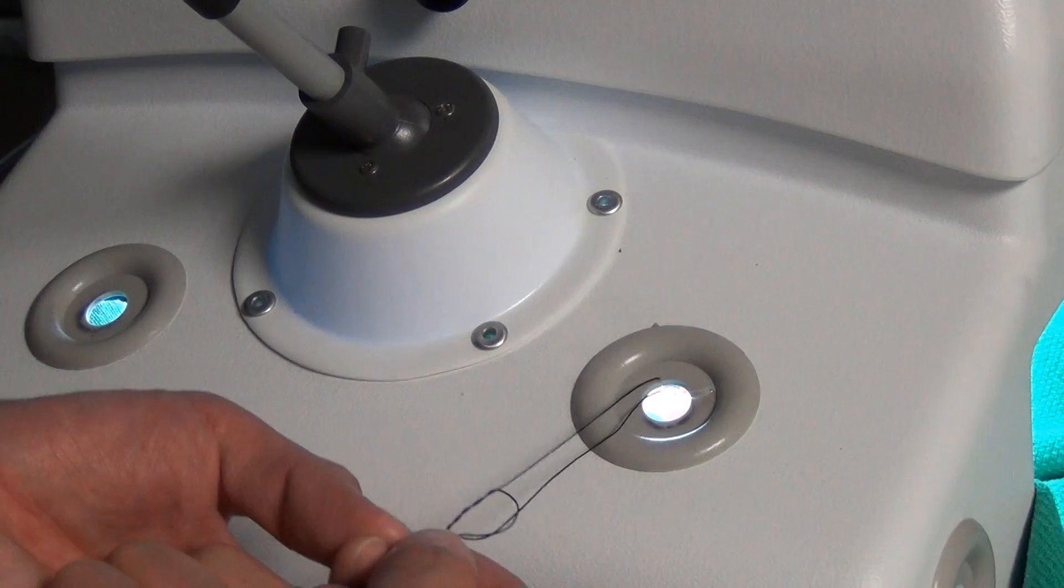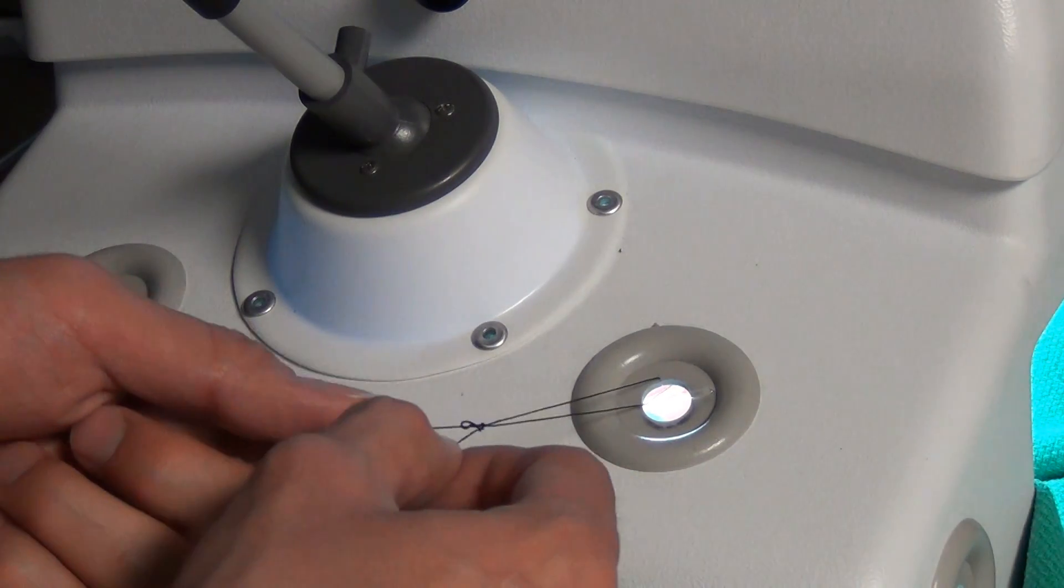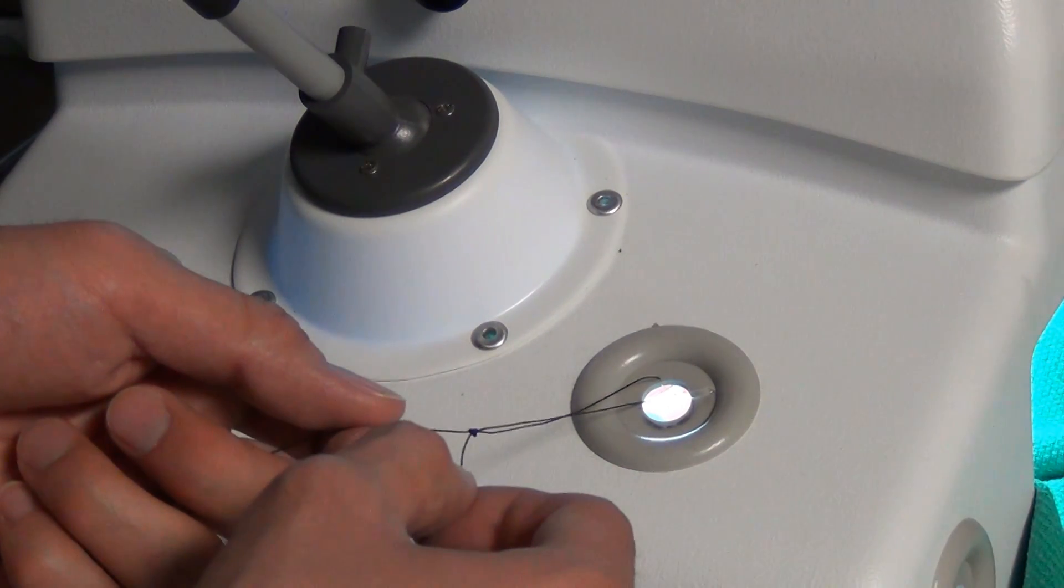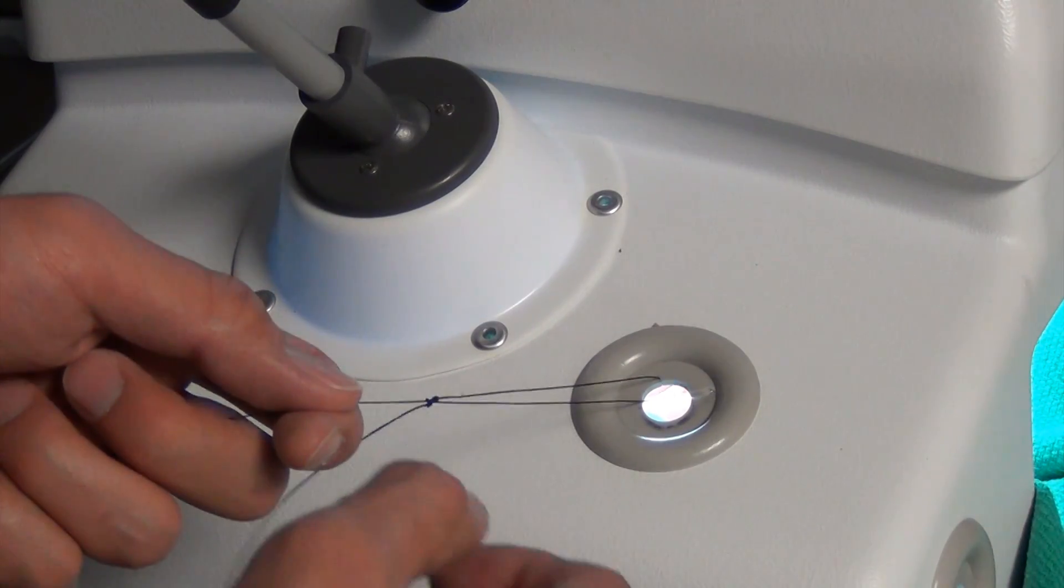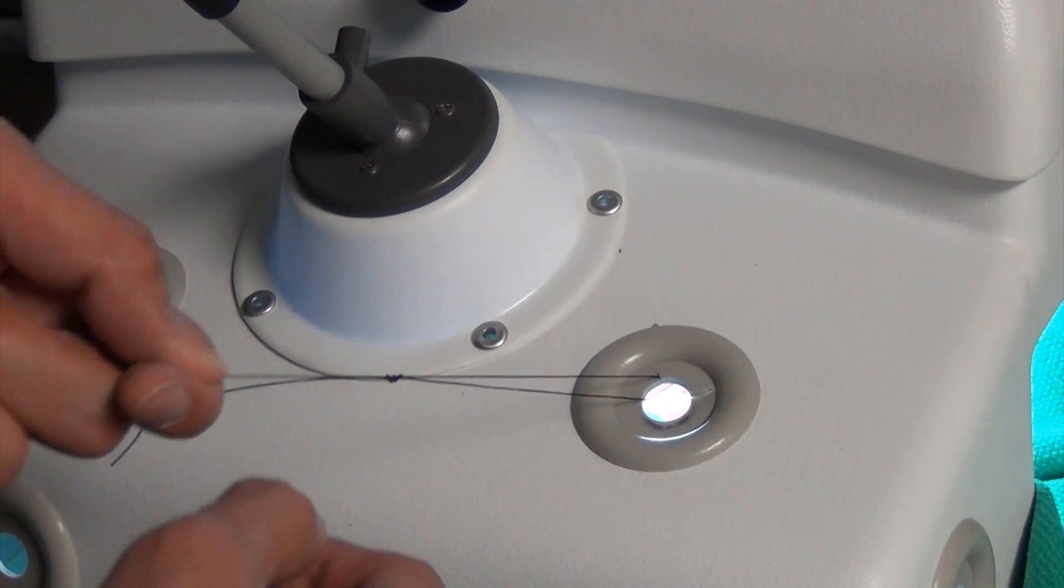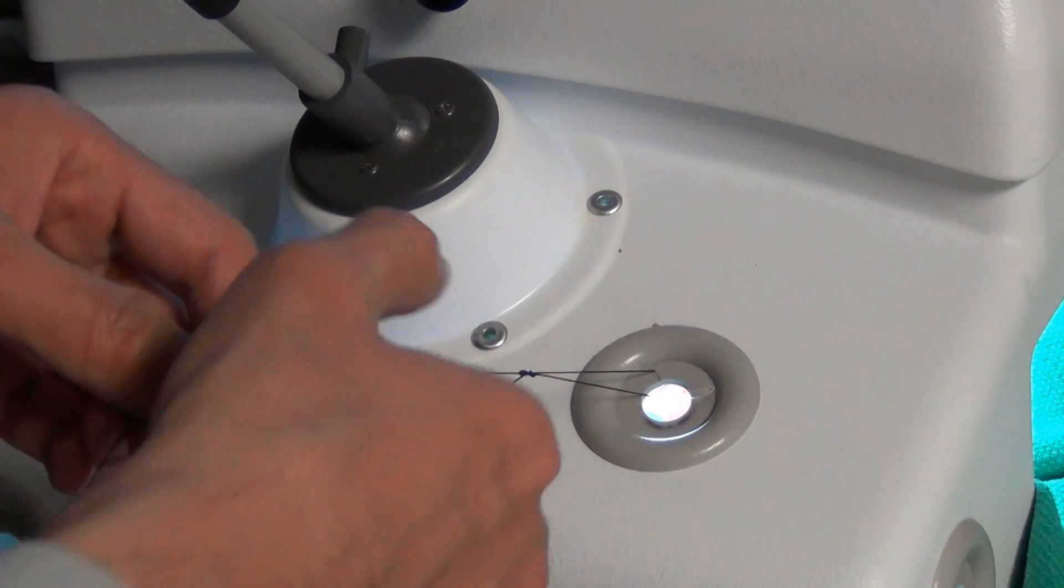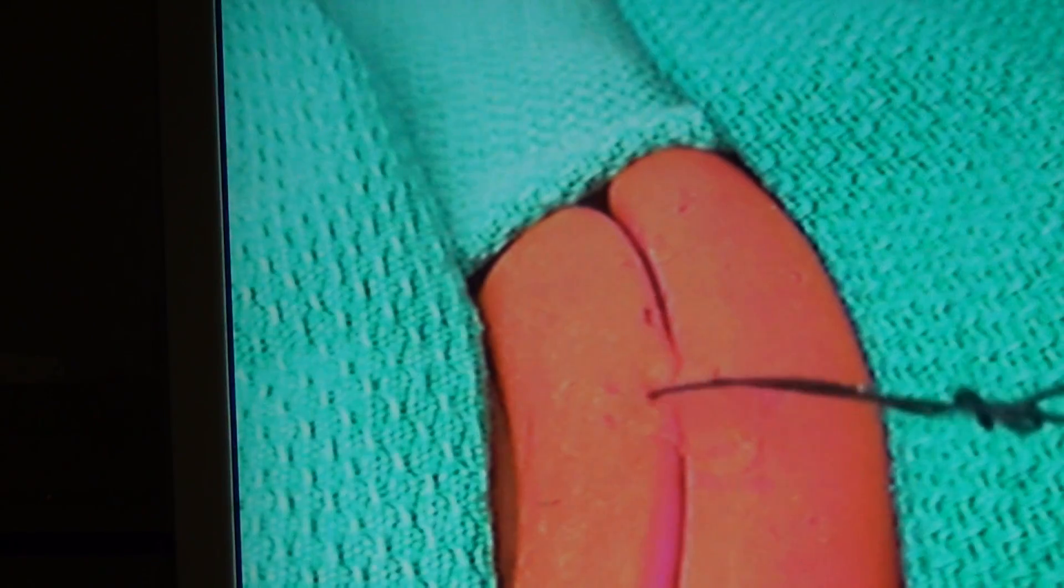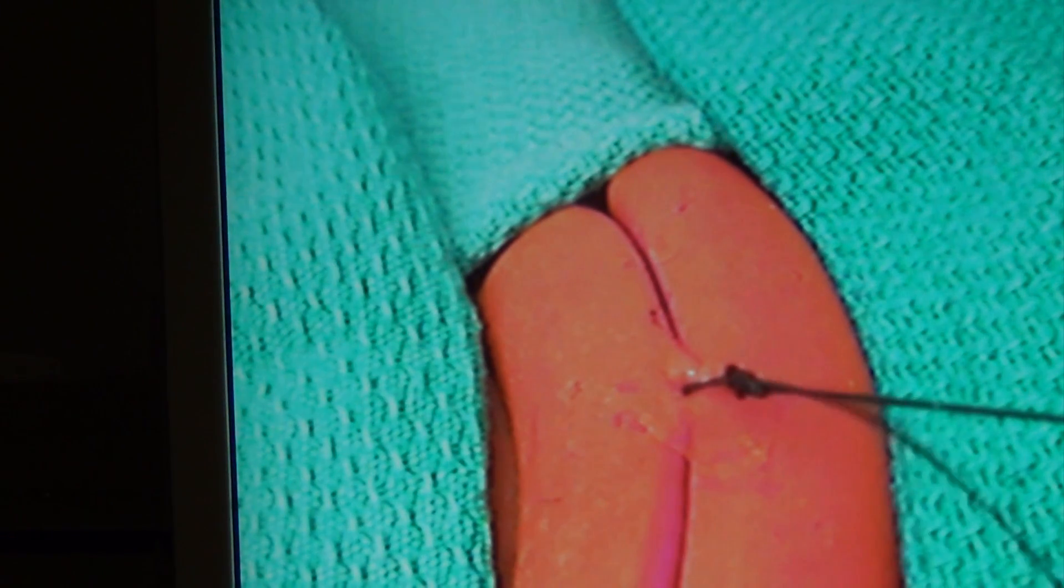Pull on the tail end of the suture to tighten the knot. Water can be dripped on the suture to lubricate and facilitate sliding the knot intracorporeally. Pull on the needle end of the suture to bring the knot close to the tissue. Pull and tighten the knot over the tissue.